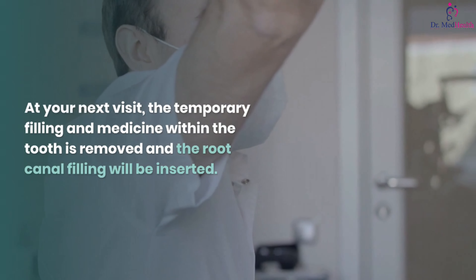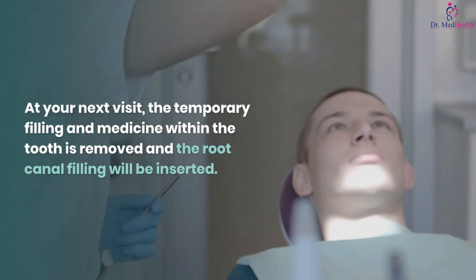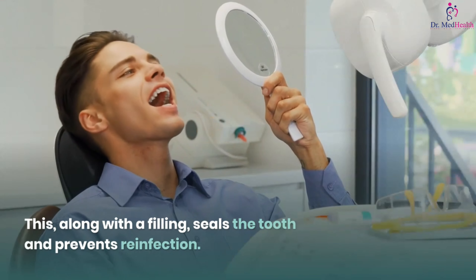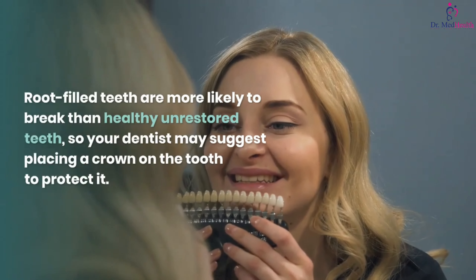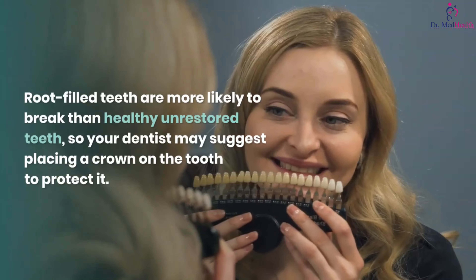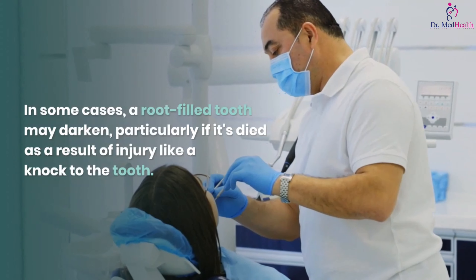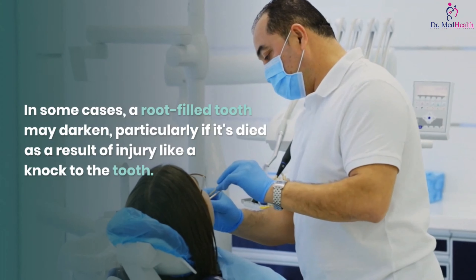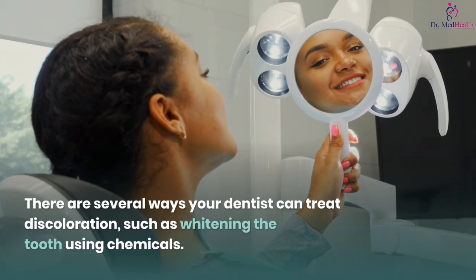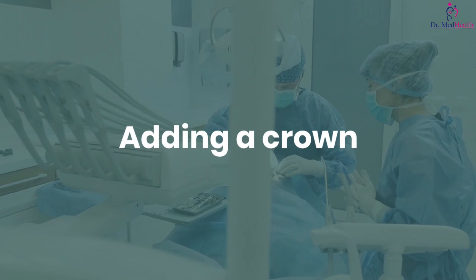Sealing and fixing the tooth. At your next visit, the temporary filling and medicine within the tooth is removed and the root canal filling will be inserted. This, along with a filling, seals the tooth and prevents reinfection. Root-filled teeth are more likely to break than healthy unrestored teeth, so your dentist may suggest placing a crown on the tooth to protect it. In some cases a root-filled tooth may darken, particularly if it's died as a result of injury like a knock to the tooth. There are several ways your dentist can treat discoloration, such as whitening the tooth using chemicals.